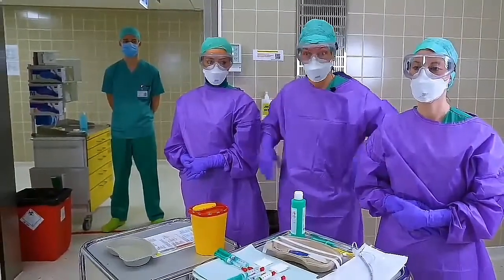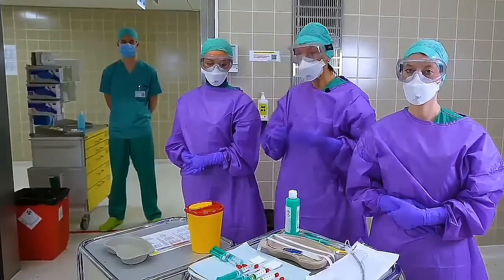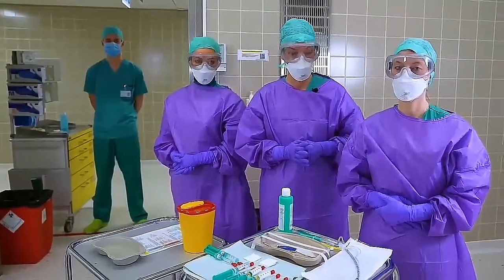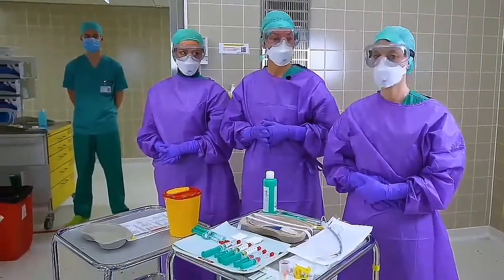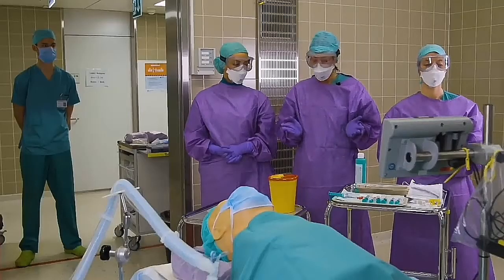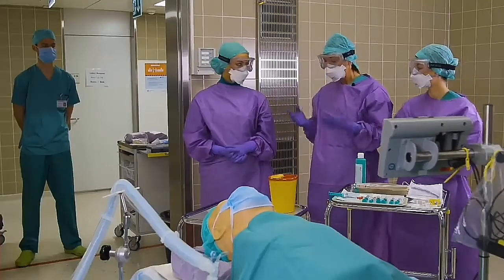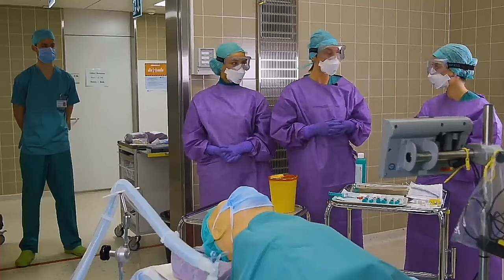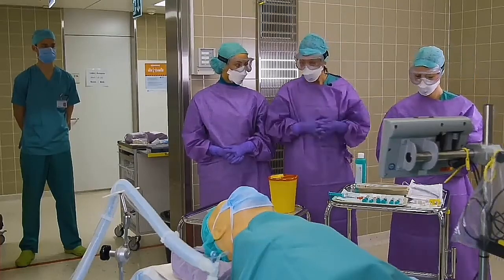Our concept is divided in 3 phases. We have the planning phase, intubation and extubation, as well as postoperative care. All these phases are equally important. First, we have the planning, and as you can see, we are all donned in protective gear, which is according to your local SOPs. We did our body check and we deemed each other appropriate for this procedure.